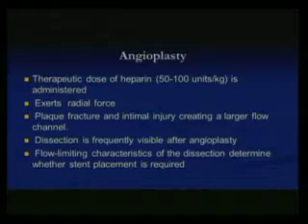And so therapeutic dose, we talked about 50 to 100 units. Most of the people do 80. I usually tend to do 100 units per kilogram. So in the angioplasty, you exert more radial force. There is plaque rupture, intimal injury, but this causes a larger flow channel. That's the purpose of angioplasty.